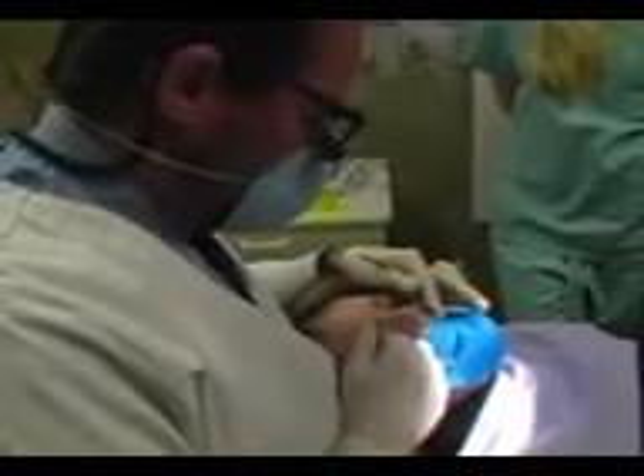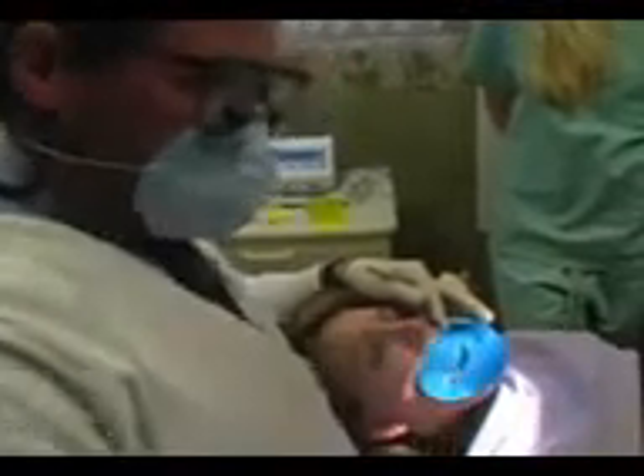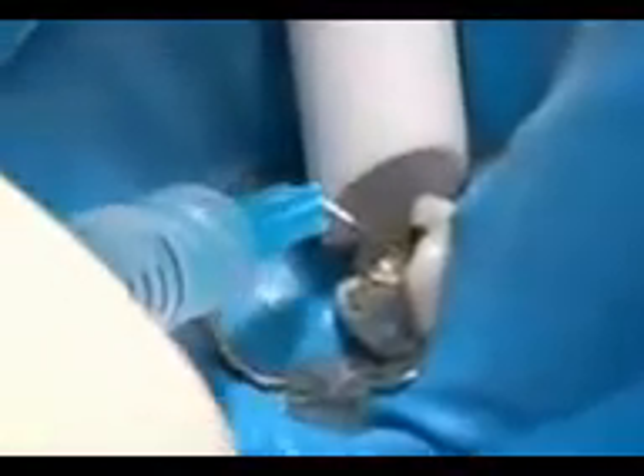Sheila is doing fine and not having any problems — probably watching the TV up out of view. We're just cleaning everything out and making sure there's no more infected tissue in the tooth. After the tooth is shaped, we'll let the sodium hypochlorite sit inside the canal for about five to ten minutes, which allows the tooth to disinfect even further before we fill it. It also gives the patient a break.